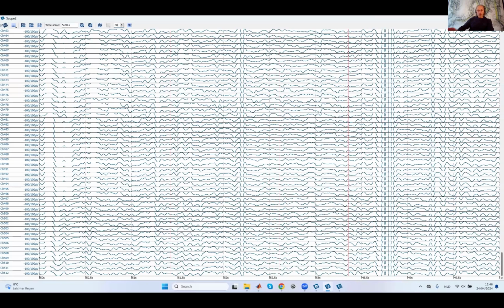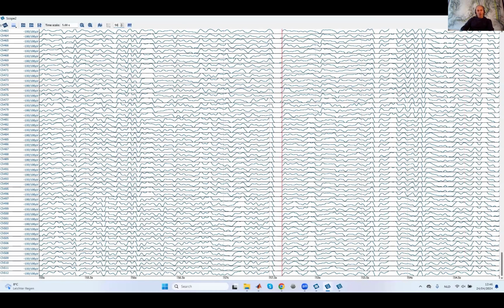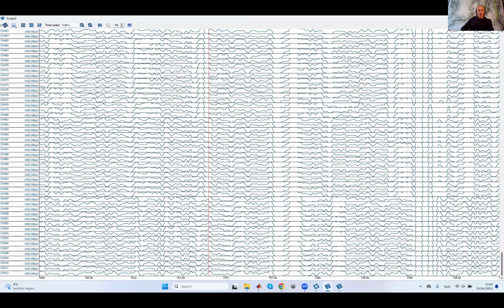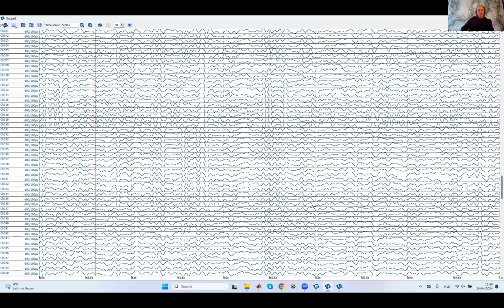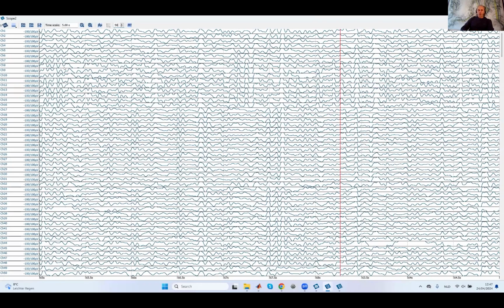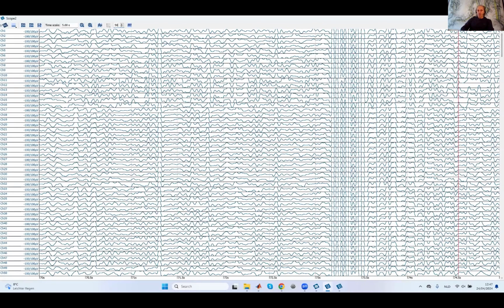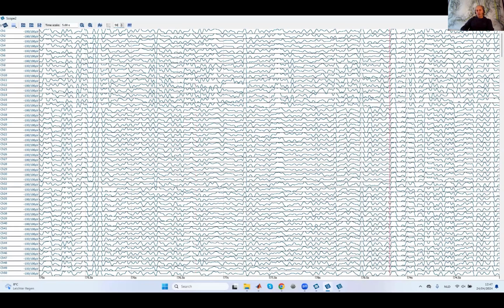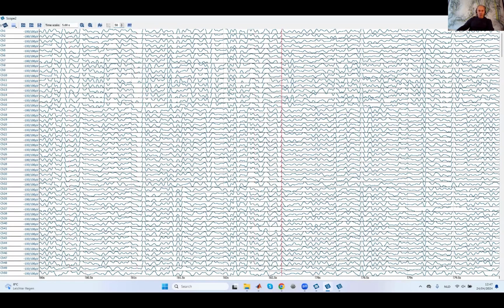Also in traditional EEG recordings, we see a slightly different waveform in neighbor channels, and exactly the same is happening here with the g.PANGOLIN. But the resolution, like mentioned before, is 8.6 millimeters. And this is super important. Otherwise, we would just collect the same information with all these 1024 electrodes. But you can see very nicely here that this is not the case, and all the channels have distinct information.